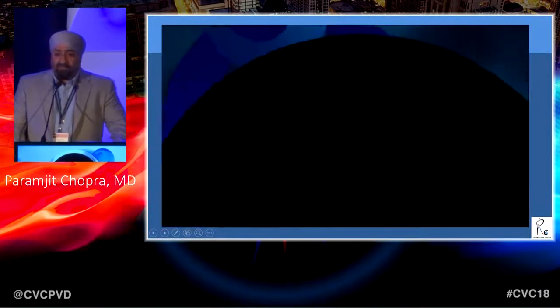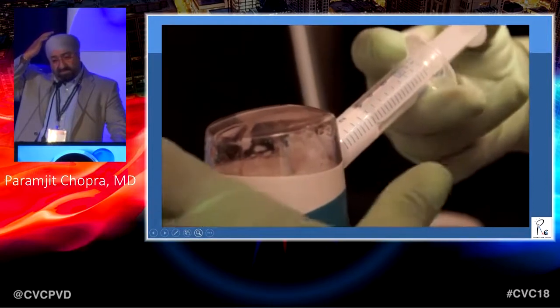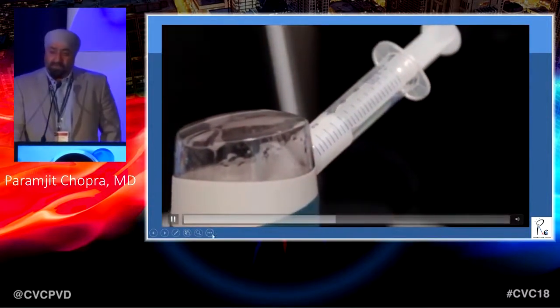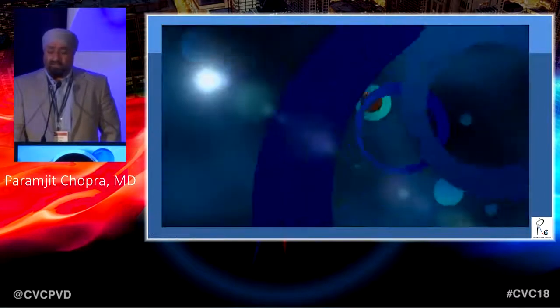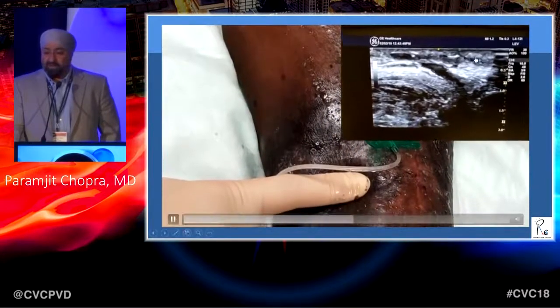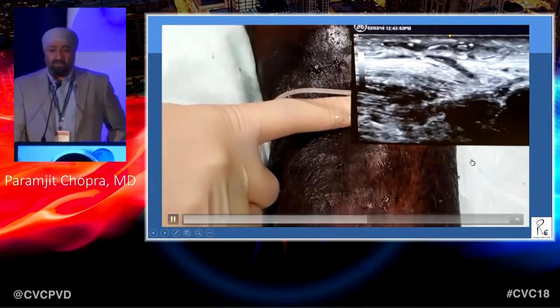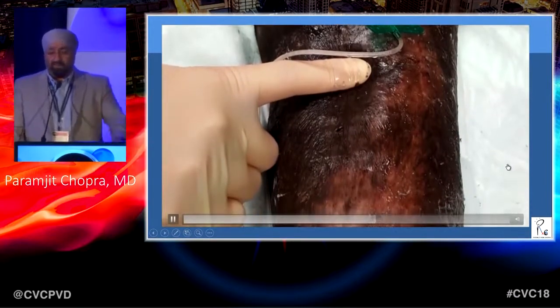And then less is more for me. I make sure I'm not overdoing this. And take about 5 cc's of Varithena there. Then put it in that area, allow this to completely spasm out, so to speak, empty the vessel, raise the leg a little bit, make sure it's empty. And I get it up to the perforator. You see, there's the perforator. I'll make sure the foam comes up to there and I compress this spot. Because there's enough debate. Ron doesn't care if it goes in. But if too much goes in, I have a complication, I can't defend myself. So I say, yeah, I've compressed the perforator.